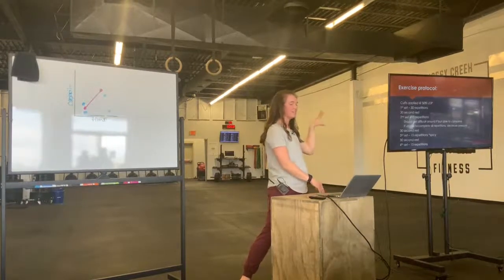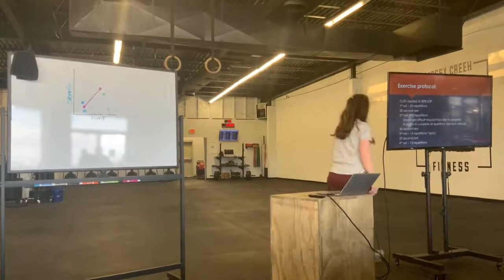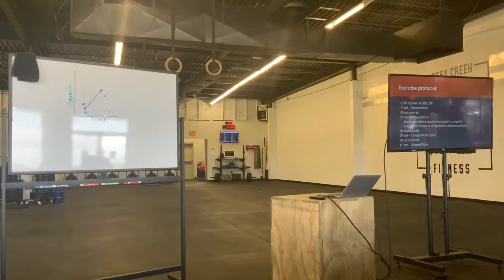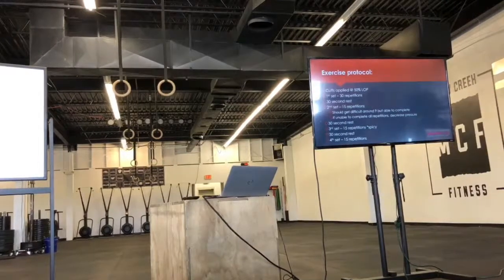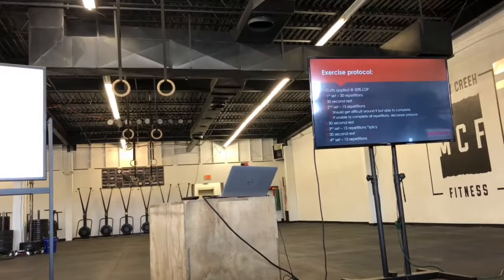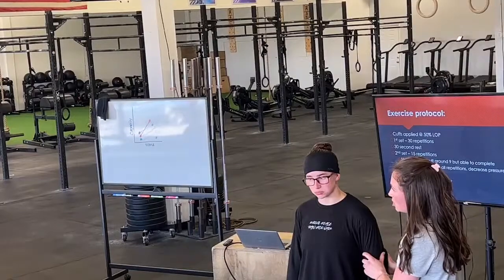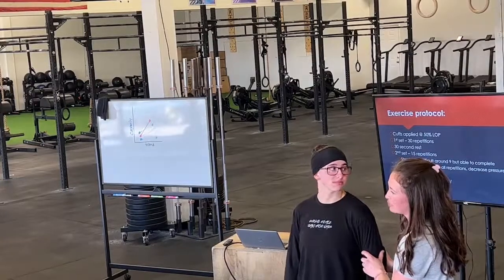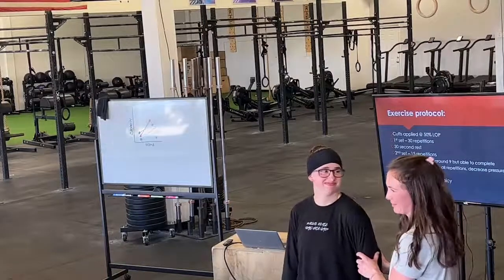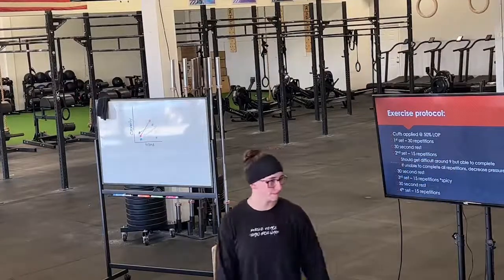Okay, so this is just kind of like the standard exercise protocol, okay? So we're gonna say, this is basic, right? But we're just gonna keep it simple, just so y'all can kind of experience this. We're gonna say that she has a bicep strain, okay? Which is now affecting her, what's a good movement that we need bicep strength for? Reverse, yeah, there we go, pull-ups, perfect. She can't pull up because her bicep's strained. So we're gonna apply the cuff.